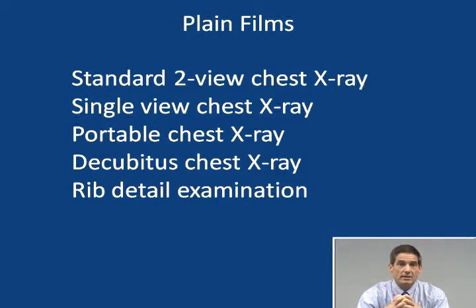Single view chest x-ray, one direction only, is done if you're really worried about radiation. If it's a follow-up study, sometimes in other circumstances. A portable x-ray. Of course, portable x-rays are good for those patients who are direly ill in the emergency room or on the patient floor that can't be transported to the department. They're going to magnify the cardiomediastinal silhouette. They're not going to be as good a quality as an upright two-view chest.